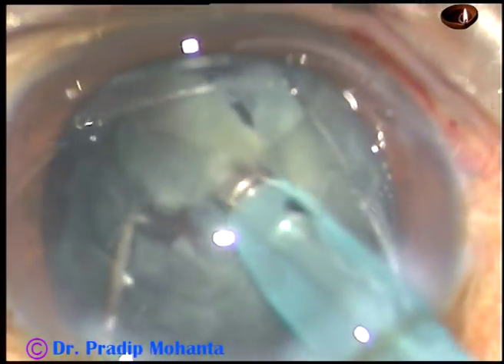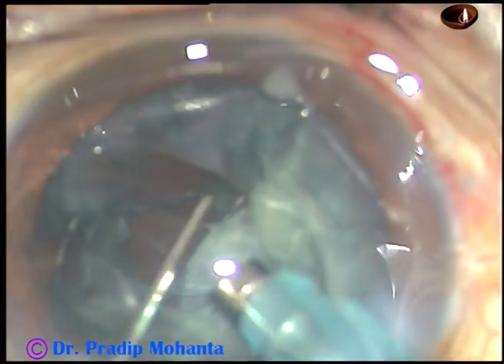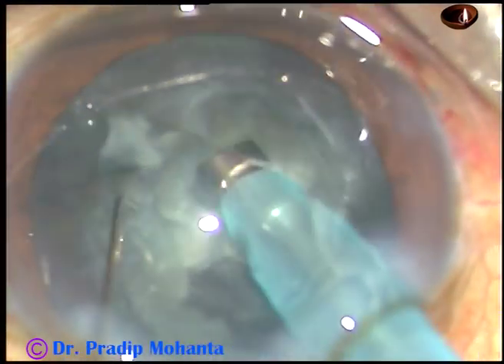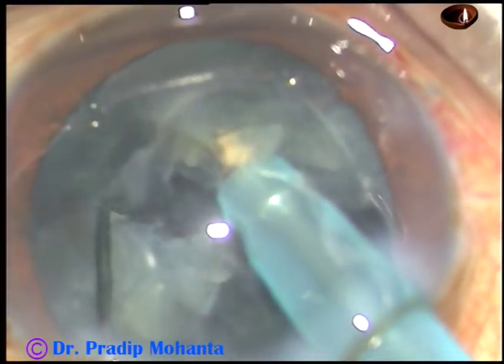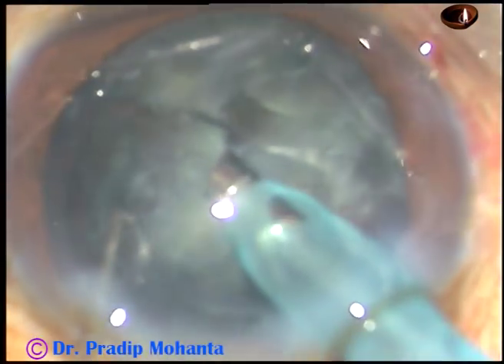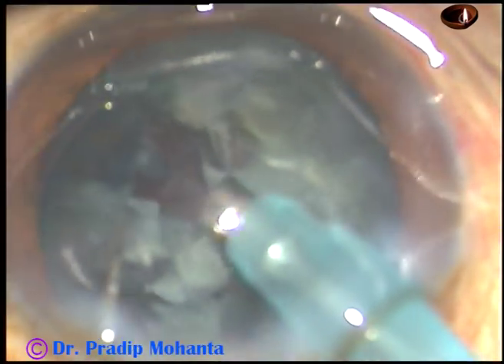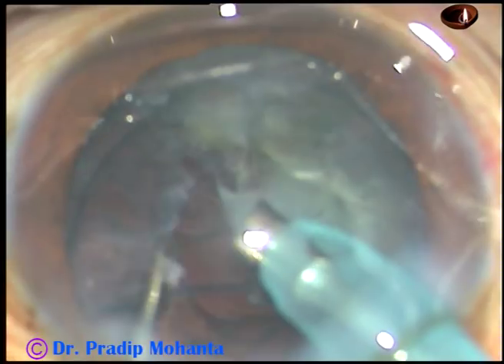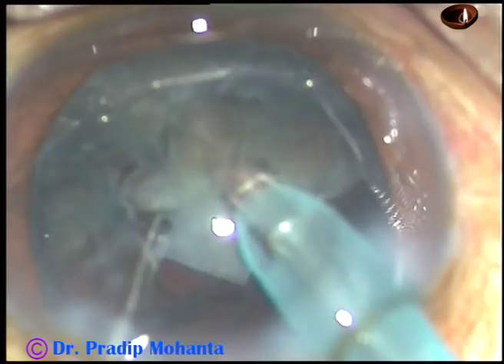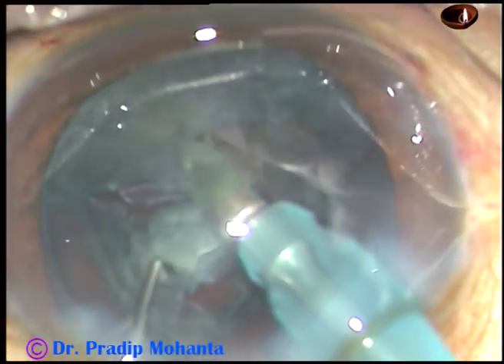Now I make another chop, emulsify and remove. I rotate it and make one more chop. Phaco power being used is 60 percent, flow rate is 45 ml per minute, and vacuum is 450 mmHg.